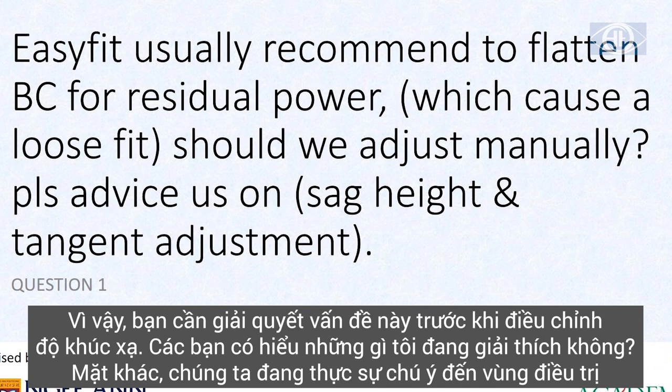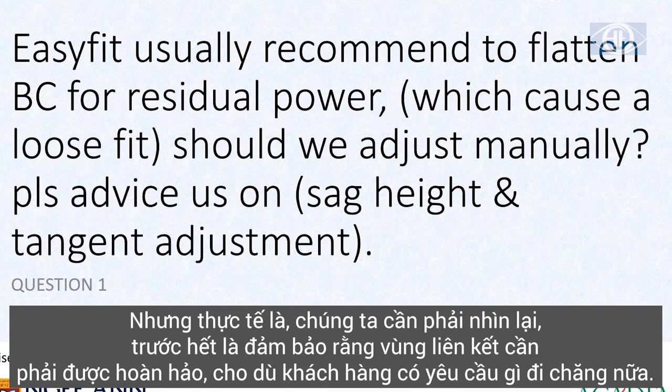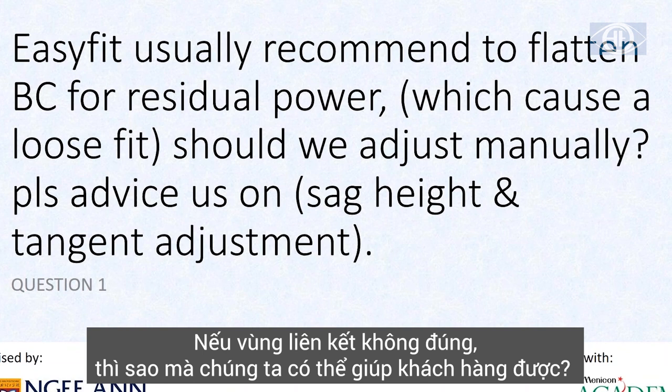So we, in that way, and I agree, and I can imagine that we all think that the sagittal and the central area is the most important, because our patient, that's what our customer experiences, if he's looking clearly, yes or no. But in fact, we as specialists have to step back and first make sure the alignment zone has to be perfect, no matter what the patient says. If the alignment zone is correct, then we can really help the patient. Make sense? Yeah, it does make a lot of sense.